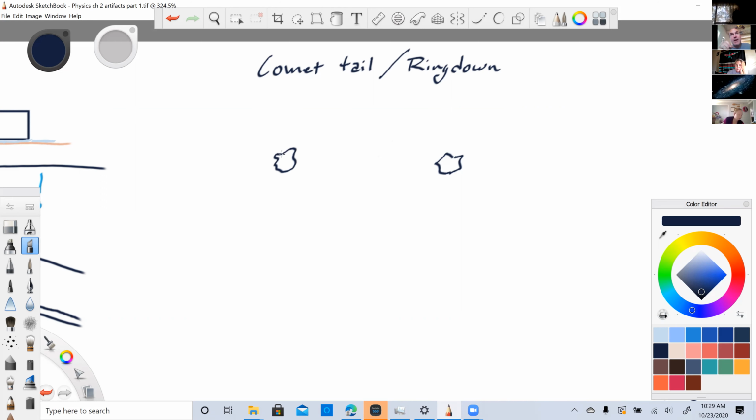Now, a lot of times in comet tails, we see these in the wall of the gallbladder. It specifies a very specific disease state, not bad disease, but still a disease state. And this is a very specific type of reverberation artifact. I don't know if anyone's 100% sure of exactly how this is working. In the case of the gallbladder, it is a tiny little cholesterol crystal, to be specific, and whether it's just vibrating or sound is bouncing back and forth, either way, what you get is a reverb artifact.